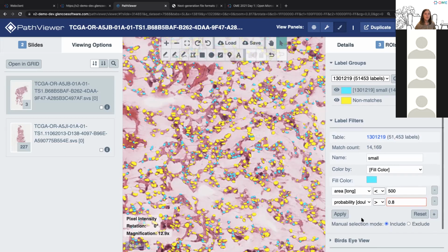With your dense, interesting measurements, you can imagine using this to curate what we're calling label groups. Maybe they're small objects, maybe they're immune cells, maybe they are epithelial cells, with particular thresholds and particular intensity channels, or maybe certain things about the shapes of those cells. So things like circularity measurements might be relevant, size measurements might be relevant.